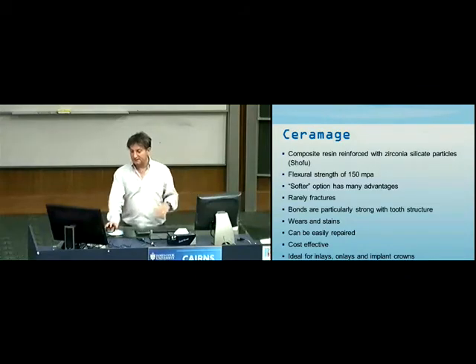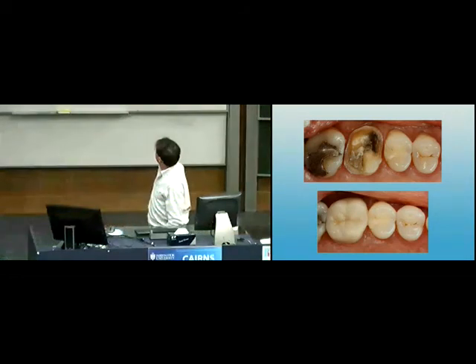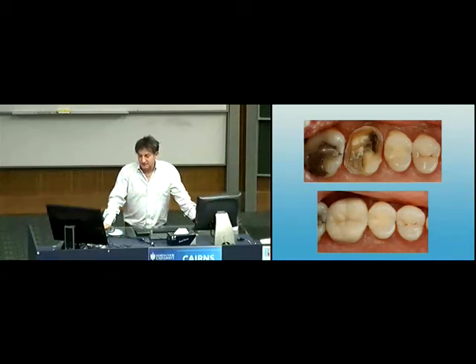A typical example of what I would do, in the type of restorations I'm doing a lot of, is onlays. And I'm sorry about the reproduction on this. I'm not quite sure how good this is. But the upper left six, I'll often try and leave as much tooth structure in as I possibly can, and I'll do onlays. And now this is a Ceramage onlay. This was probably taken about 4 or 5 years ago now.